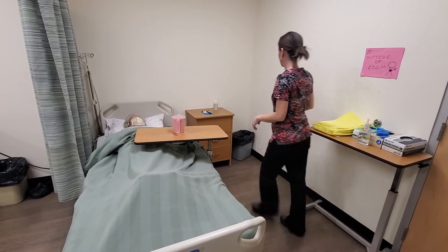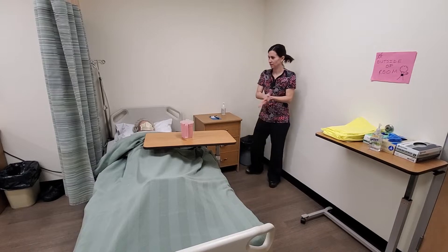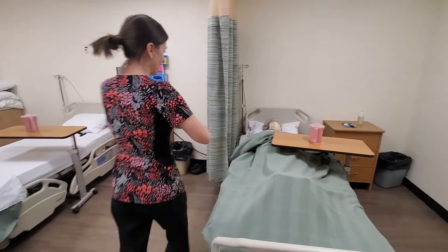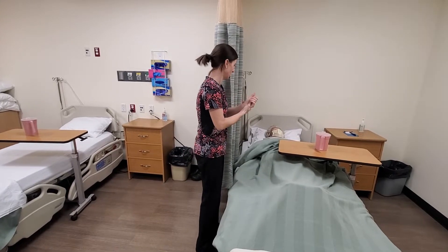I'm going to go ahead and do my hand hygiene, rub it in until completely dry. I'll pull the curtain for privacy. I'm going to get some supplies and I'll be right back.